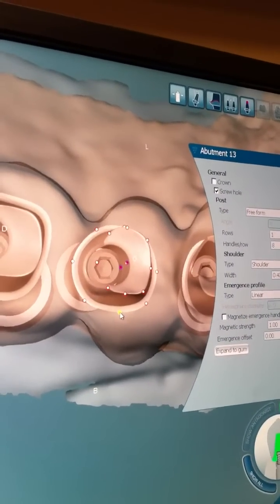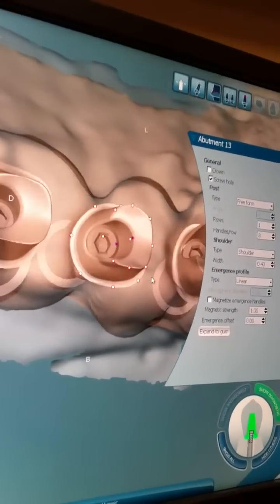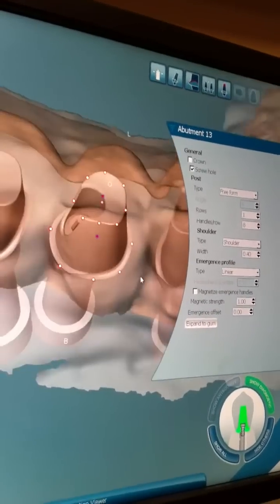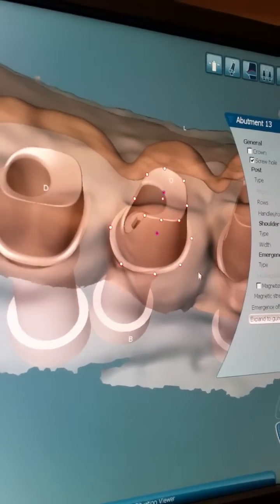So, Mike, your attention to detail as far as radiuses and line angles, everything must be rolling, soft, S contour. Yes, correct. You know, don't give the tissue a chance to harbor any bacteria. We just want to make it go in as passively as possible.